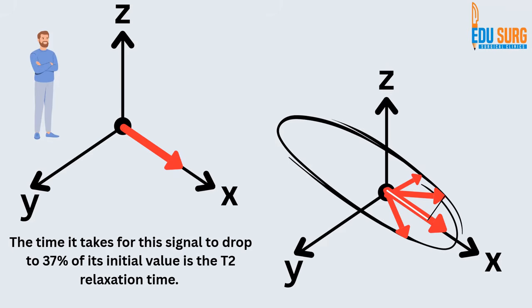Now, there is a concept called the spin-echo sequence, where you give another 180-degree pulse right when these things are dephasing. So you give one more 180-degree pulse, and that will again align them in the XY plane and increase the signal in T2. Okay, so spin-echo is basically going to make T2 more bright, right? So that is the concept of giving two RF pulses, also known as the spin-echo sequence.